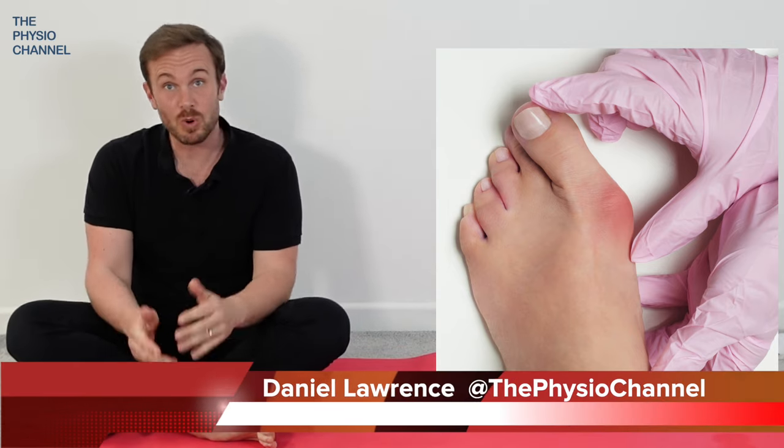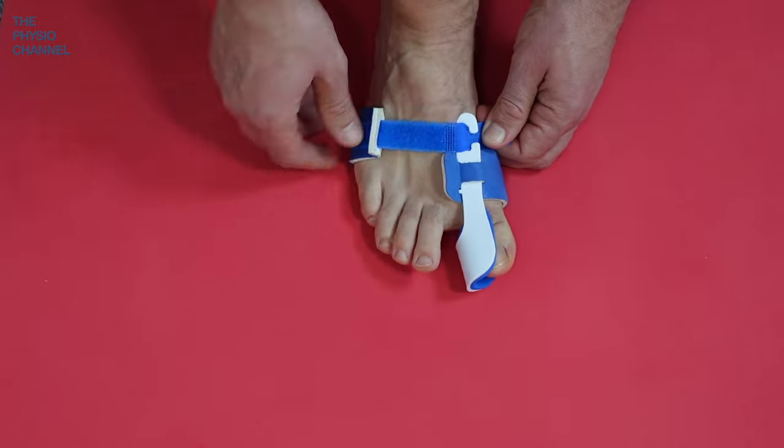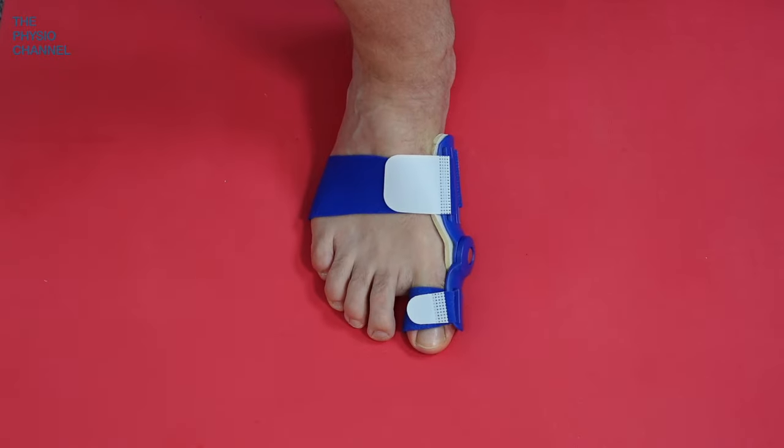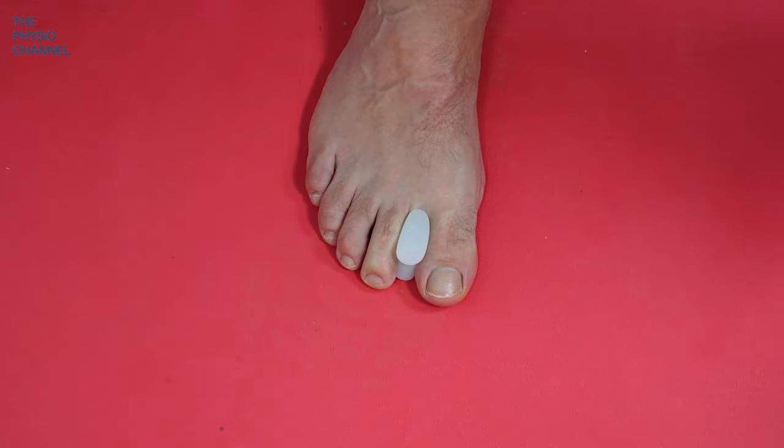If you suffer from bunions or hallux valgus, the good news is that an orthosis like this can really help. Even simple toe spacers can help to significantly reduce pain.